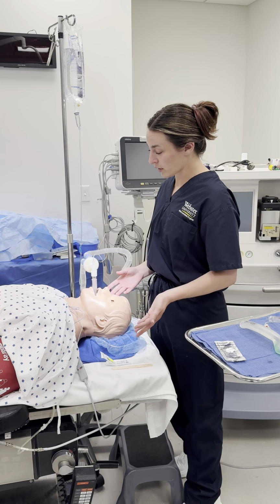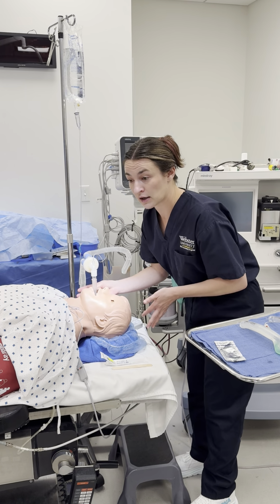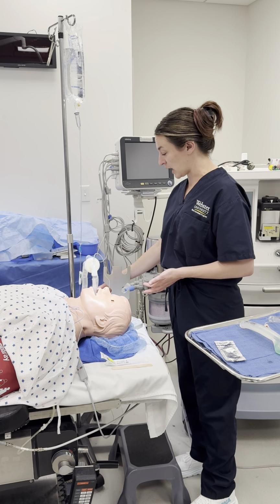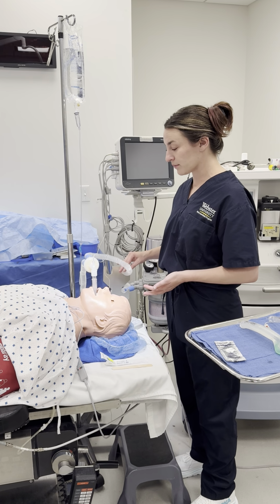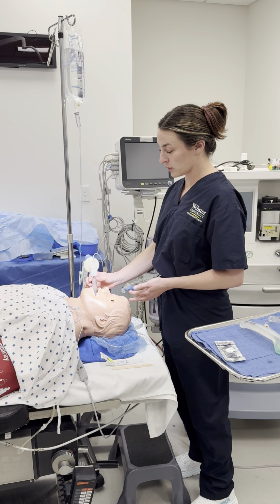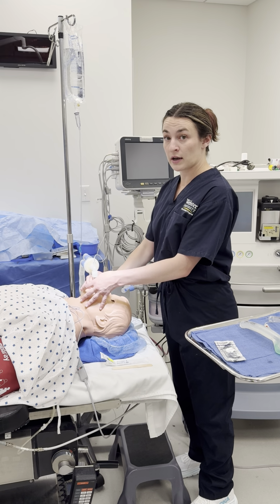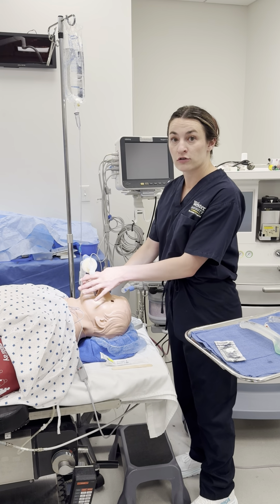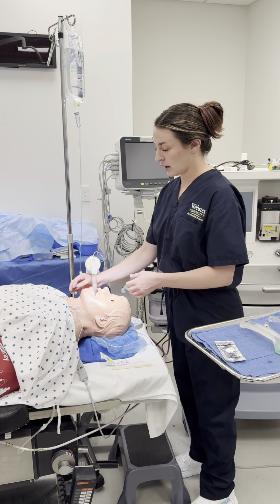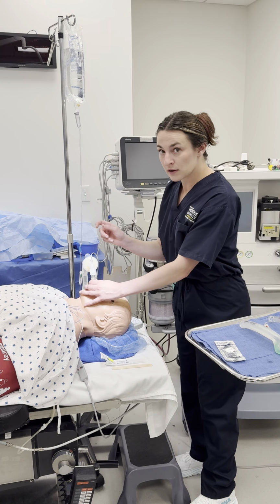Things we're going to want to look for is we're going to listen, and we're going to make sure we don't hear any air leaking or kind of a bubbling sound coming from the seal around where the LMA sits. If this happens, you may need to insert deeper further into the patient, or you may need to come back. It's kind of a troubleshooting thing, so you're just going to see what works. Other things I've done is I've kind of manipulated here just to help it seat a little bit.